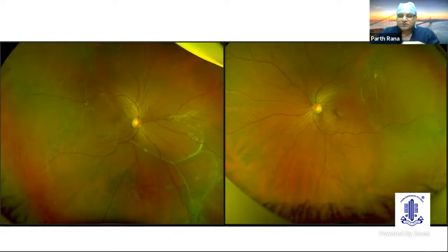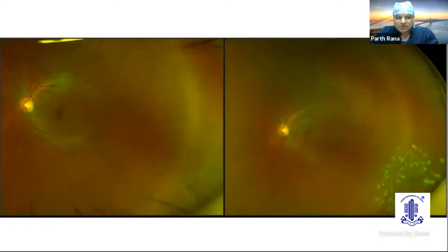A general ophthalmologist sent the patient to me and I saw the patient. I explained to her and showed her the retinal photo. Then she had something in mind, like, okay, I can have a retina and it can also detach. There's one more patient who came to me with a retinal hole. When we explained, the patient was not able to understand how a hole can happen in a retina. So we showed the patient, this is your retinal hole.